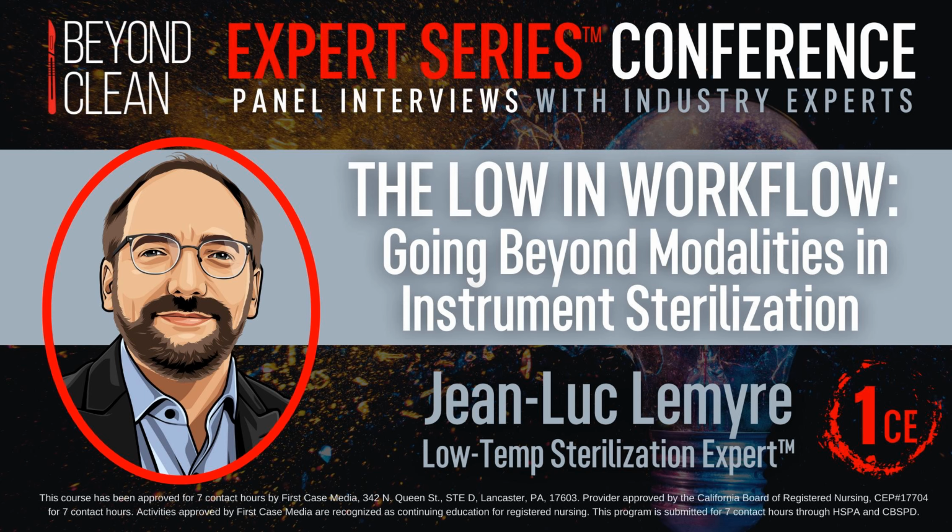Yeah, so two things, and I'll explain the why of it, so it makes more sense to people. I explained that the first step of the low temp sterilizer is we start the pump and try to remove all of the air to reduce the pressure in the chamber. So the water, as we go into low pressures, will start to evaporate. That evaporation will take longer to reach the target pressure. And for safety reasons, all of these sterilizers have a specific timer, so that if the target pressure is not reached in the recommended time, then the cycle aborts. So that's one failure mode that will abort the cycle.